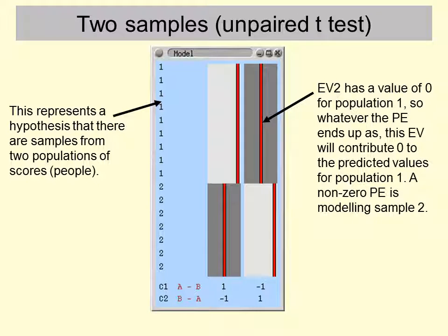So let's talk about the meaning of these contrasts now. We've set up the 1 - 1 contrast, group 1 minus group 2, or group A minus group B if you like, and the reverse, group B minus group A. So what those contrasts are asking is in effect the question, at a particular XYZ voxel location, is sample 1 more active than sample 2?